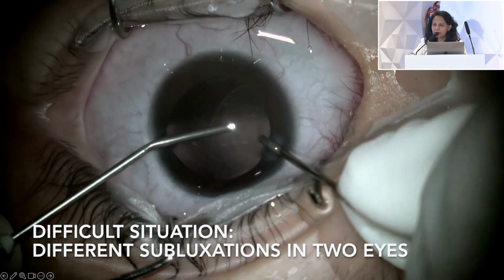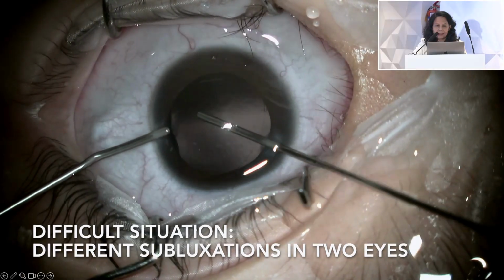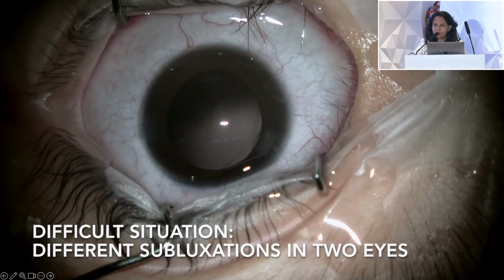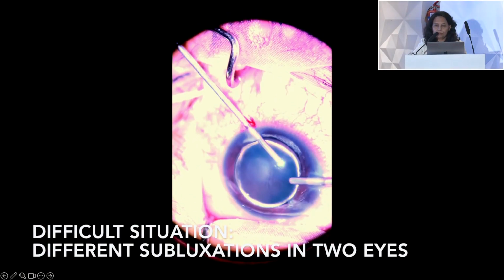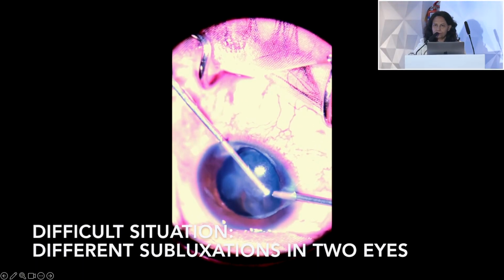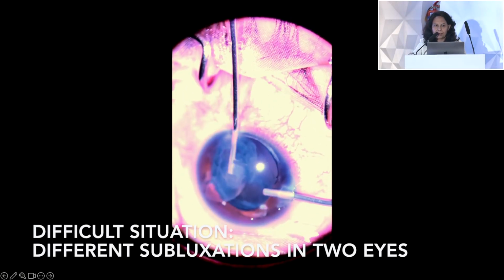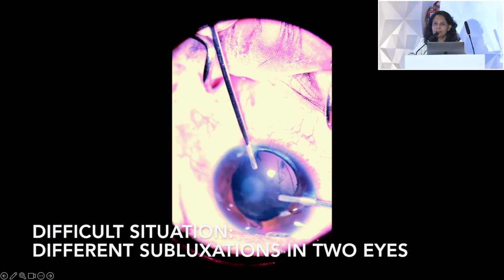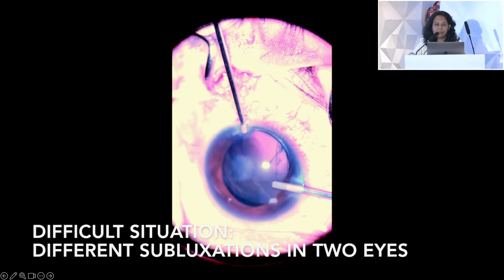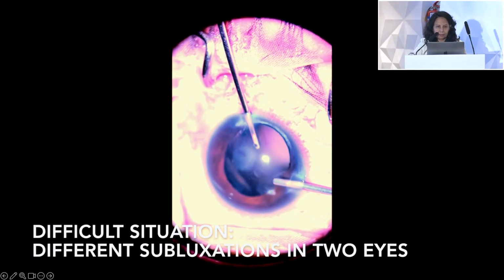It's a very large subluxation. So I did not put any CTR and I did not put any IOL in this case, because in the other eye, the child had an anterior subluxation. So sometimes it is difficult to decide which eye, what to do in these cases. If you have these types of situations, instead of doing all the things, it's always better to leave the child aphakic for a while, and then when the child grows up, we can think of scleral fixation IOL, because we don't put scleral fixation IOL before 10, 11 years old. So that is how we can manage these cataracts in severe subluxation.